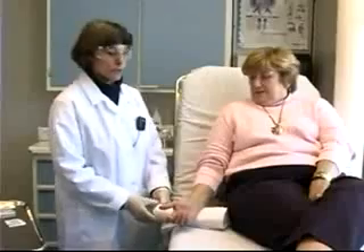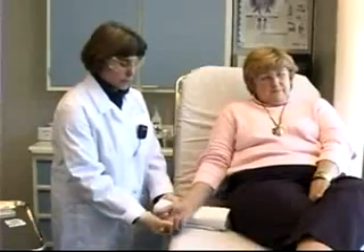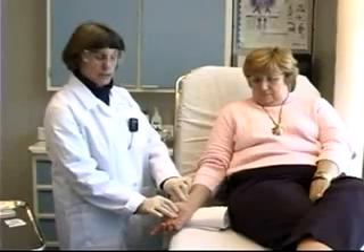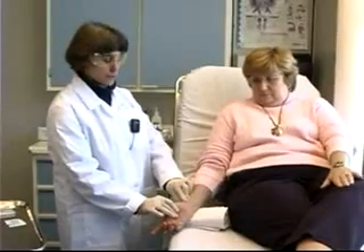With the patient seated comfortably on the stretcher, tuck a rolled-up towel underneath her wrist. This will help hyperextend the wrist slightly, which will bring the artery a little closer to the surface and make it easier to palpate.